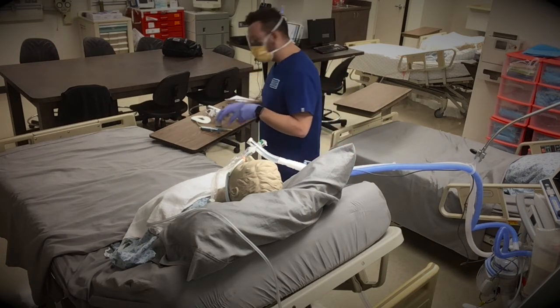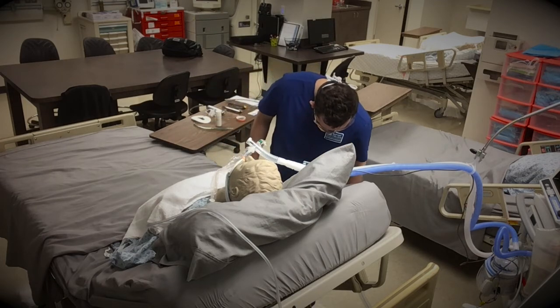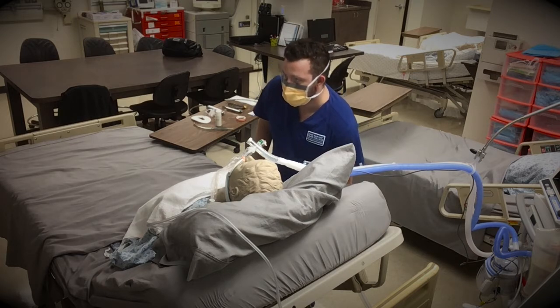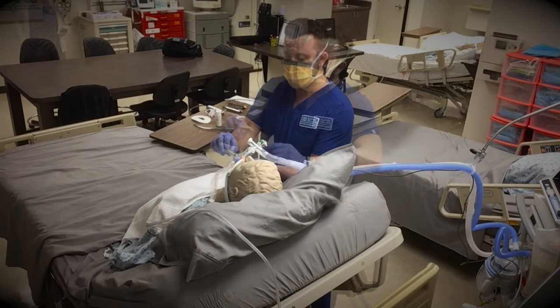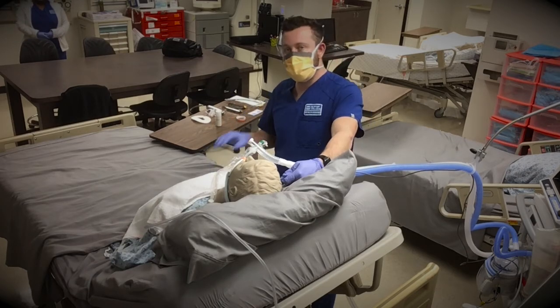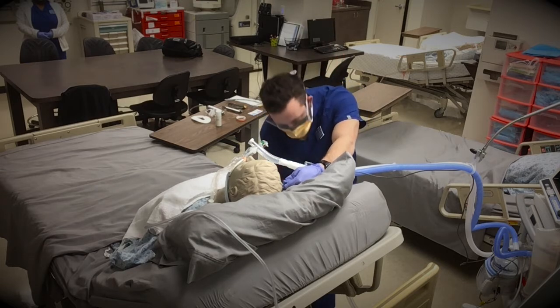we're going to deflate the cuff and do what's called a cuff leak test. The 10 ml syringe is attached to the pilot balloon. All the air is withdrawn from the cuff while the RT should listen for an audible leak around the tube.